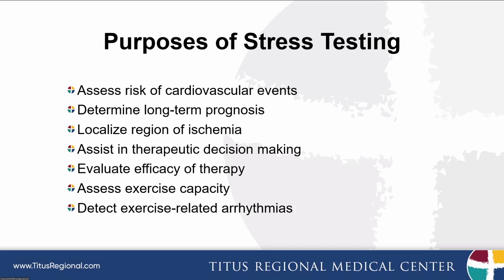And in some cases, when we're concerned about patients who might have multiple blockages in multiple spots, they can help us localize which area of the heart is actually causing the symptoms. They can help us make decisions about how to treat a patient, whether we're going to treat him with medication, whether we're going to be more invasive. They can also help us evaluate how well we're treating the patient, whether or not the medications that we started a patient on are really helping.